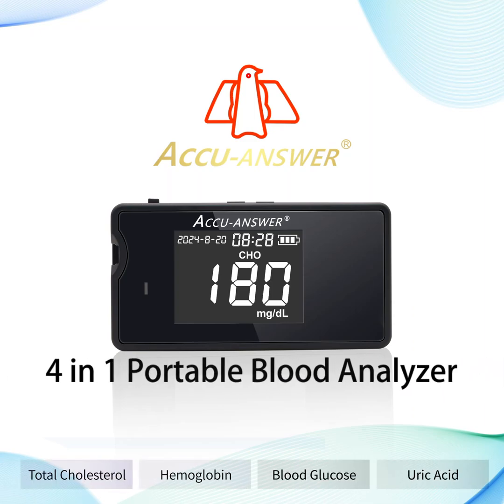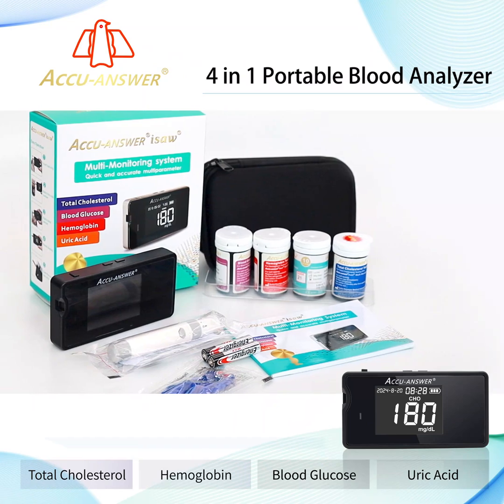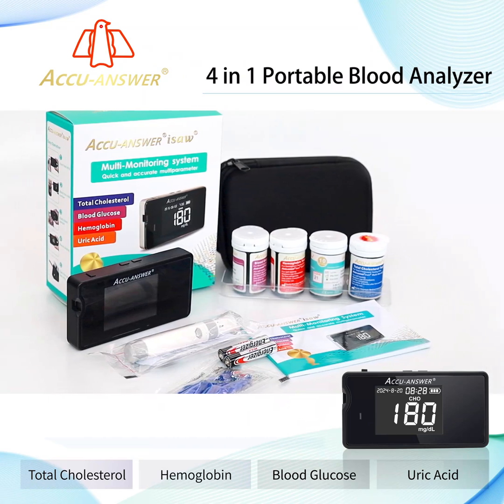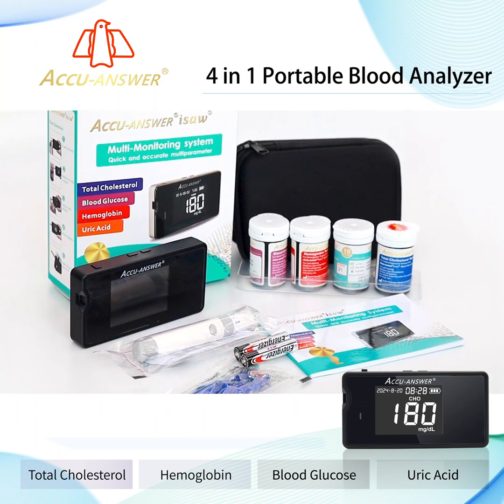The multi-monitoring meter is intended to be used for quantitative measurement of blood glucose, uric acid, total cholesterol, and hemoglobin in fresh capillary whole blood.